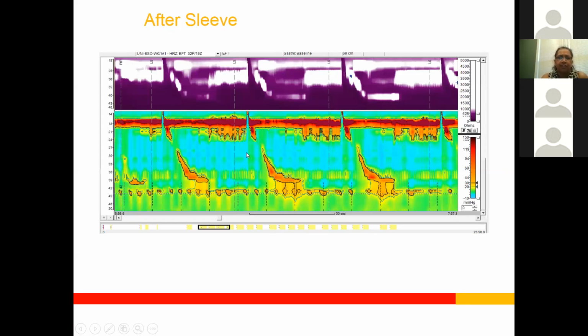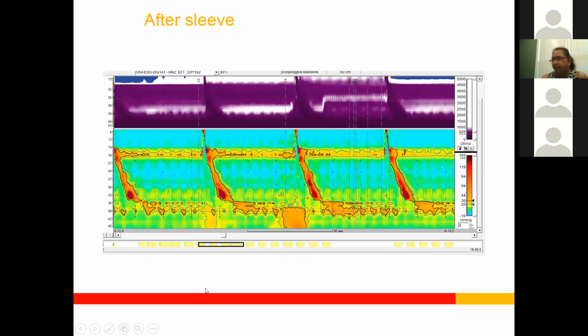This was another patient after sleeve who complained of choking at night, and so again, with high resolution manometry, we can see cool things like if you see this high pressure area between the LES and the esophageal hiatus, you can imagine that a patient swallows, food kind of sticks in here, and they have kind of an hourglass effect where food has to go through the LES and then through the hiatus. And this patient has a hypotensive LES. And down here, we don't see any pressure within the sleeve. This patient I managed with LES augmentation with a Lynx and hiatal hernia repair, and their symptoms actually improved significantly.